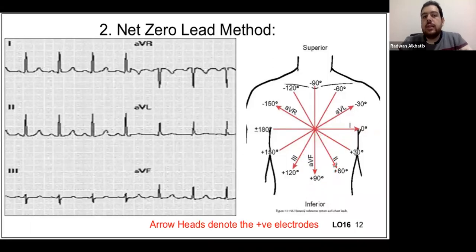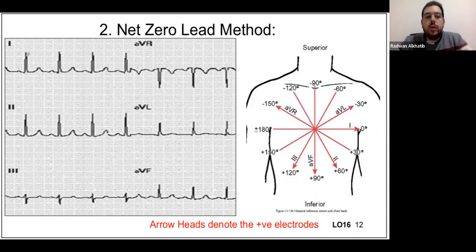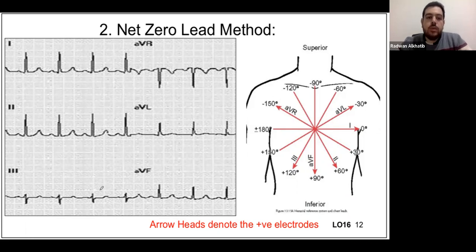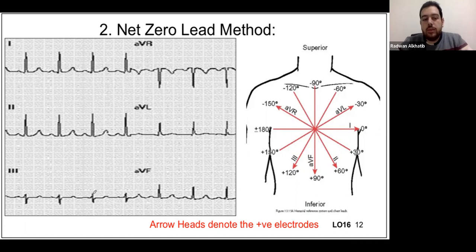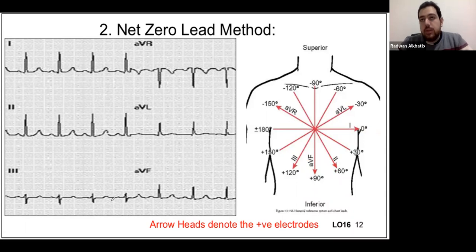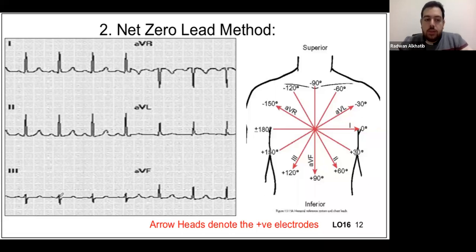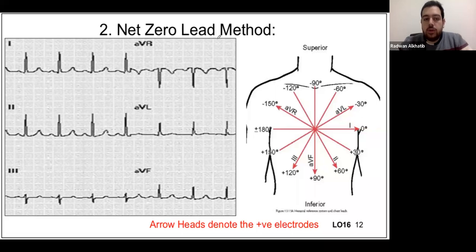The net zero lead method: we look at the six limb and augmented leads and find the one where the positive area of the QRS is approximately equal to the negative area — that's the net zero lead. We then draw a perpendicular line to it. In this example that's lead three, and the perpendicular is AVR. Since AVR is negative here, the axis is in the negative direction of AVR's perpendicular, which falls between zero and positive 90 — a normal axis.